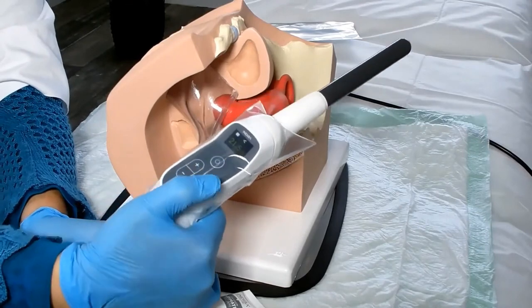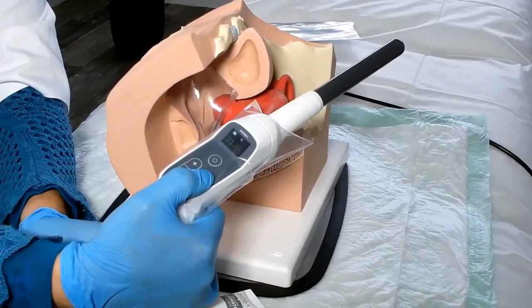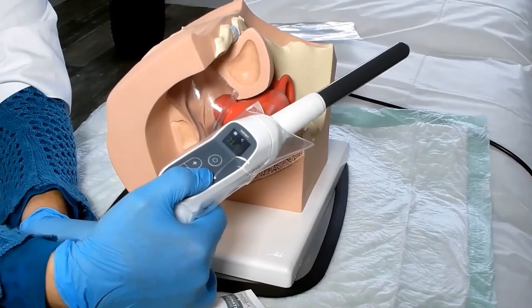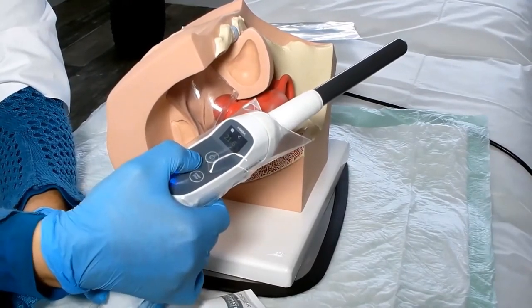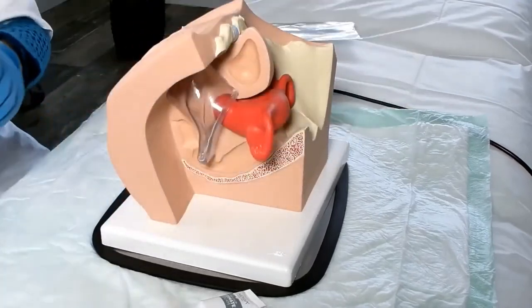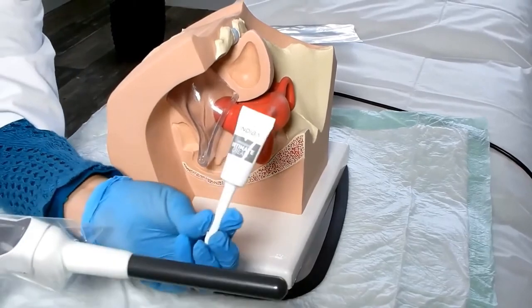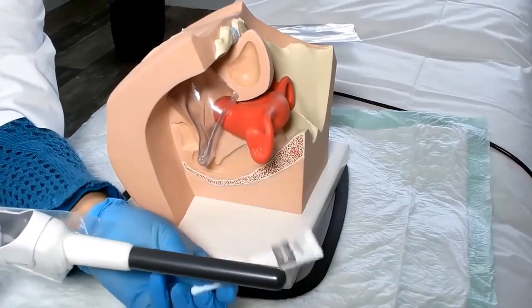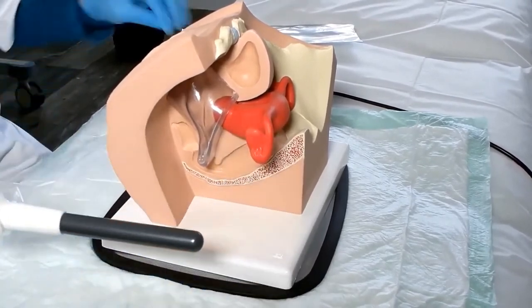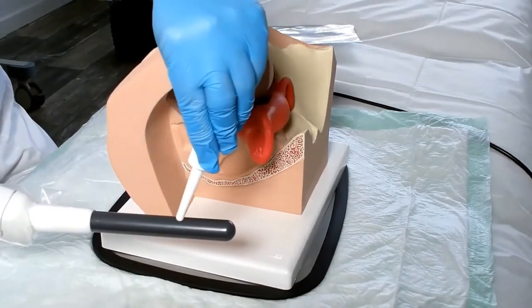Turn on the display of the intracavity handle by pressing the power button. With the device in pause, apply a small amount of intimate cream on the electrode.